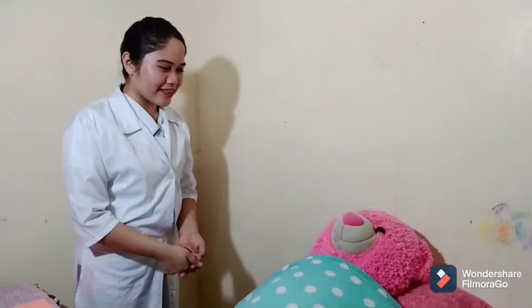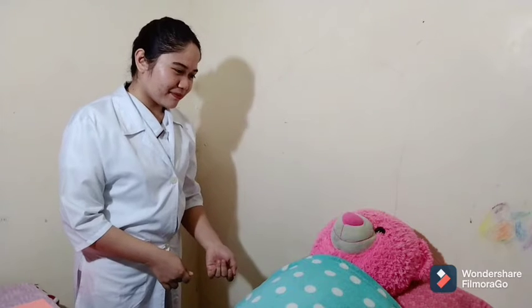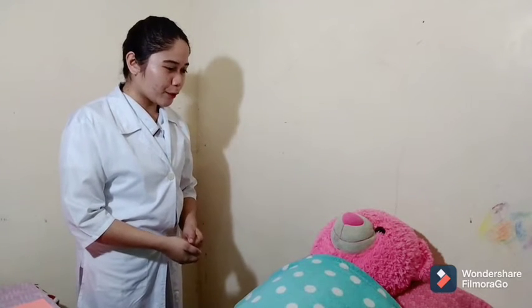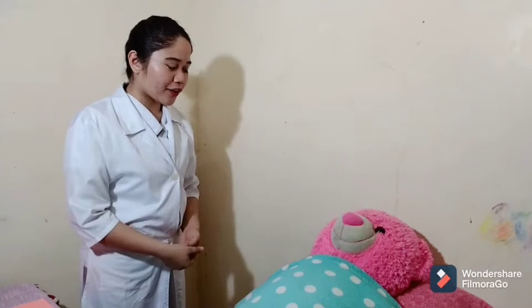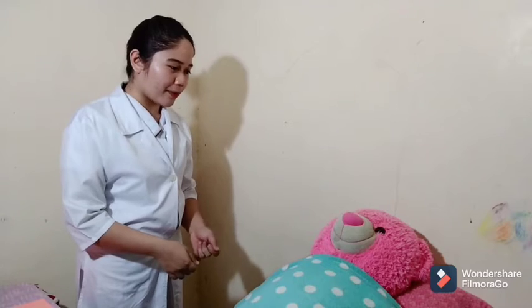Identify the client and establish rapport to ensure the right client and elicit cooperation. Today, ma'am, I am Madiga Said, your student nurse for today. What is your name and your date of birth? Now, I'm going to perform urinary catheterization to drain the urine from your bladder. Assess the need of the client for catheterization. Explain the procedure to the client to elicit cooperation.